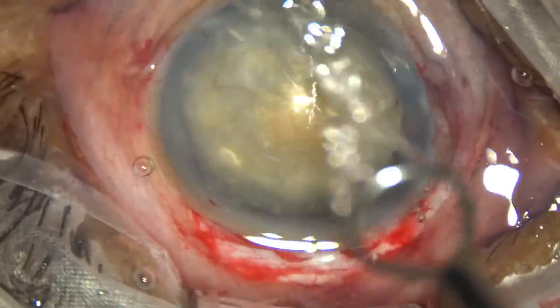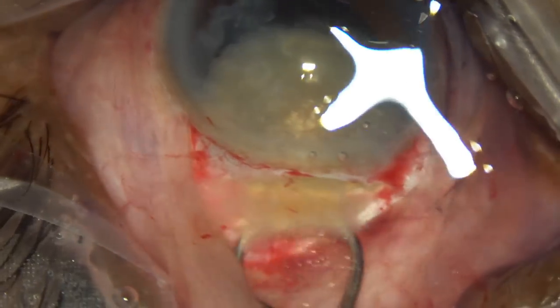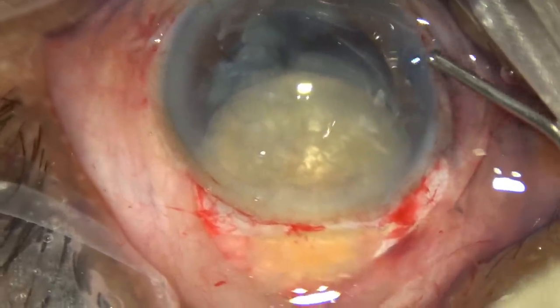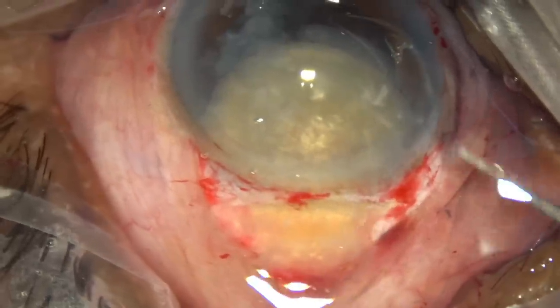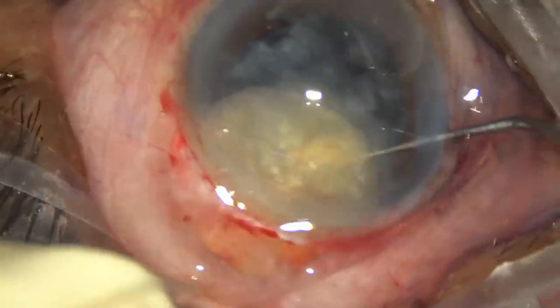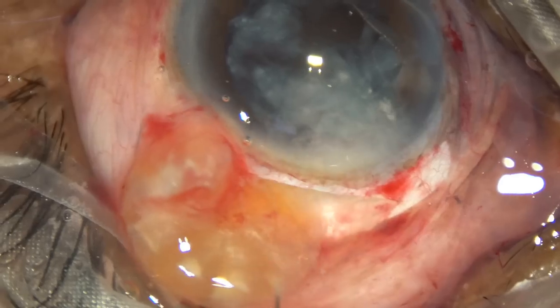Now I'm going to deliver the nucleus. Hold the superior rectus tendon, go behind the nucleus and we push it from behind, let us see if it comes out. Yes, it has come out.